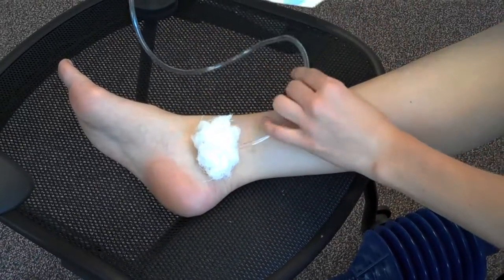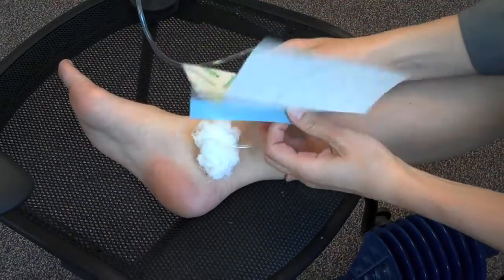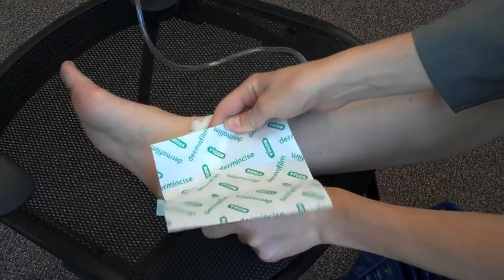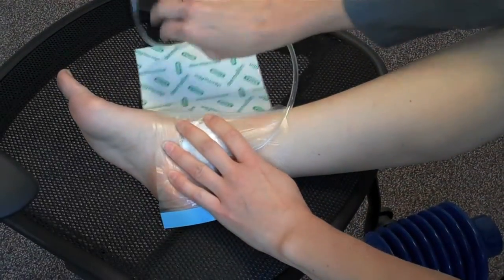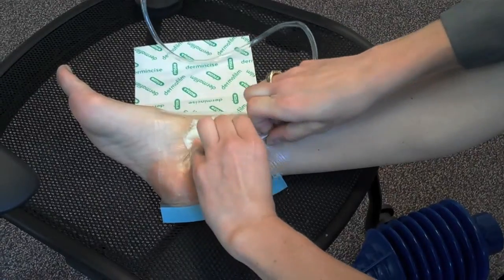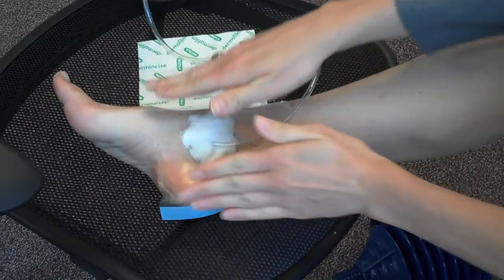Then, take whatever occlusive dressing you have in hand, and cover both the drainage tube and the gauze. Seal down your dressing, making it airtight.